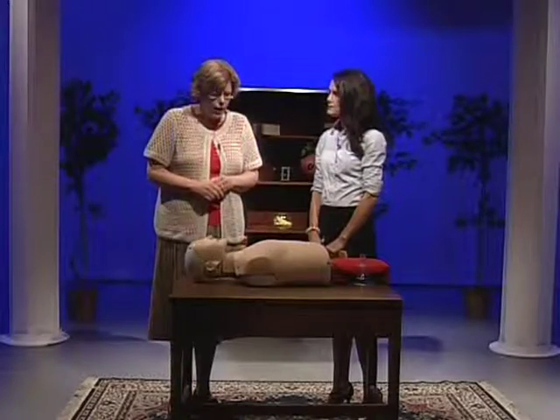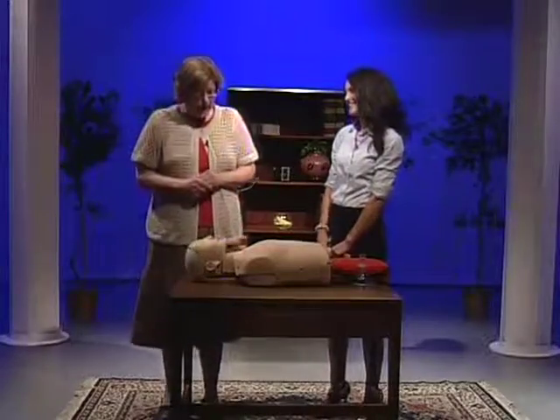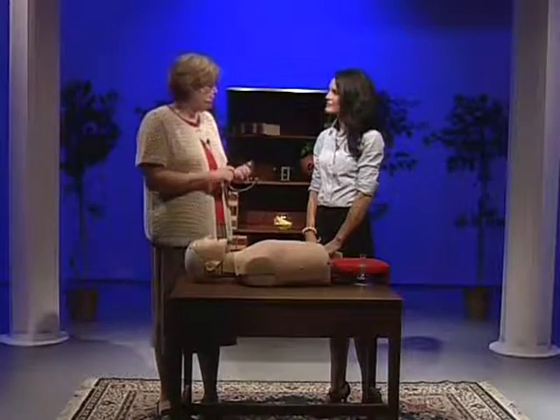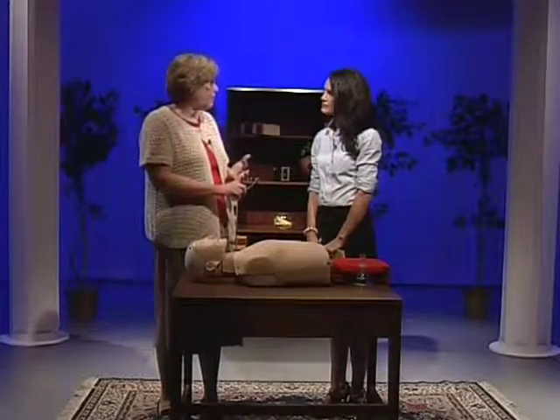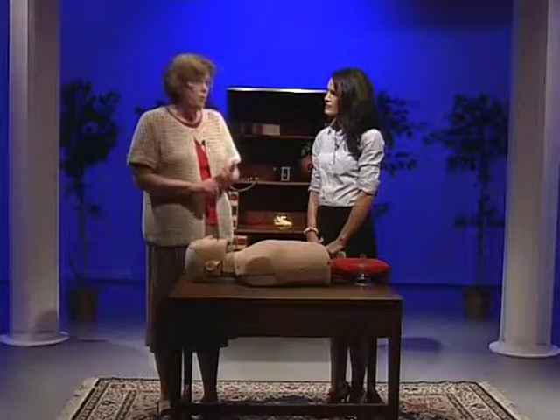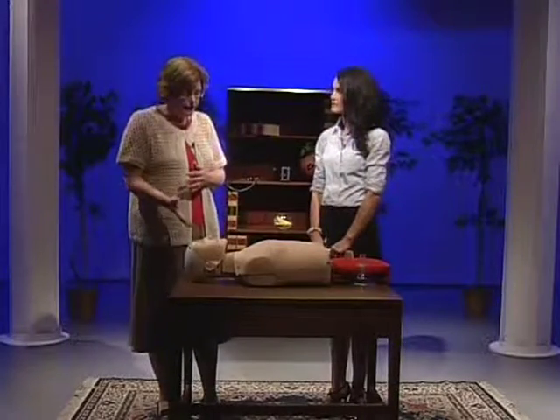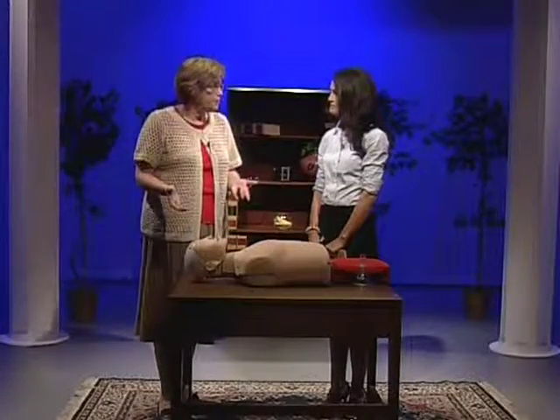So for as many years, and I won't share on TV how many years I've been teaching CPR, we've always taught it with the memory device A, B, C. We're going to do airway, then we're going to breathe them, and then we're going to do compressions and pump on their chest. The change that's going to be big is we're going to change that to CAB. So as soon as we find the victim has collapsed, there's no signs of life, I'm going to ask someone to call 911, bring me the AED, and immediately go to compressions.